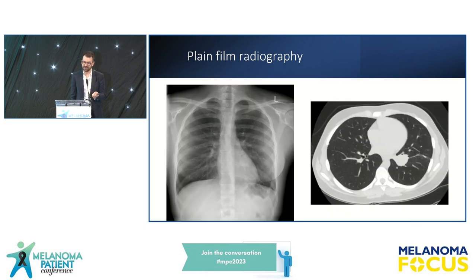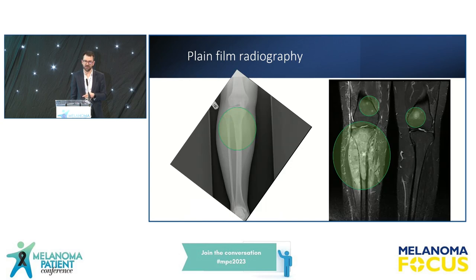And this turned out to be a nasty tumour called a sarcoma, and she also had other deposits in the femurs as well, which we couldn't spot on the x-ray. And we know from studies in animal bones, where some people with more time on their hands have hollowed out bones and then x-rayed them afterwards, that you need to lose roughly half of the bone density before we often see it on x-ray. And so you need quite a large deposit in that bone to be able to see it. So perhaps it's not the best test in these situations.